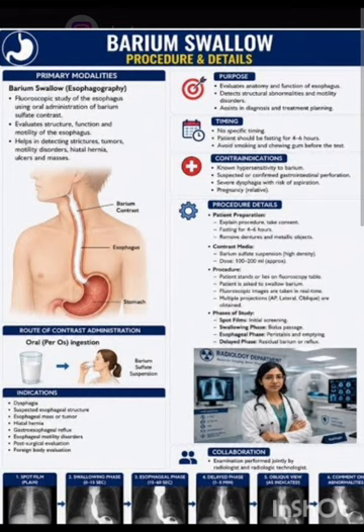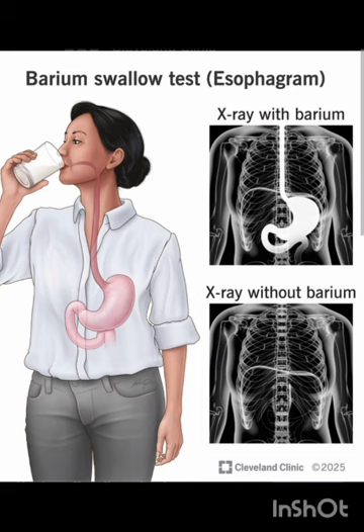After that, the effervescent powder is given to the patient, and another mouthful of barium sulfate. The radiologist observes the passage of barium under fluoroscopy and spot films are taken during adequate distension of the esophagus in AP, RPO and LPO positions.